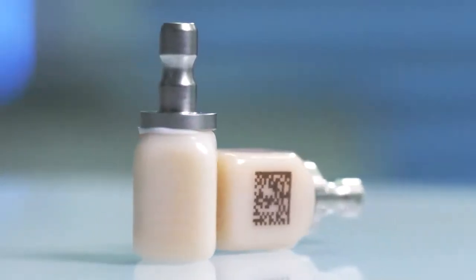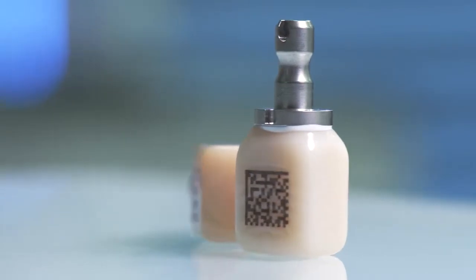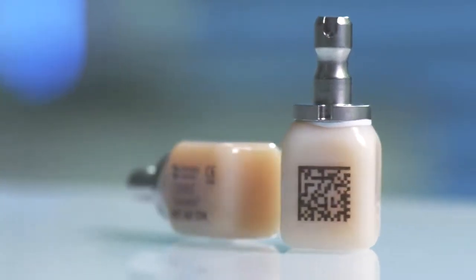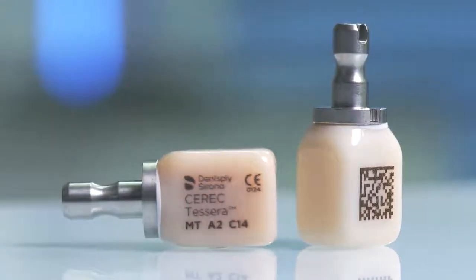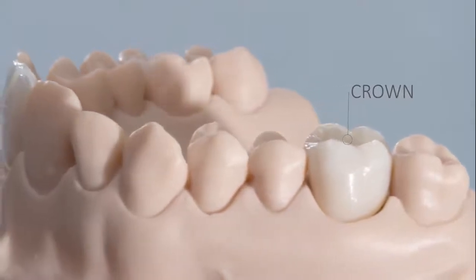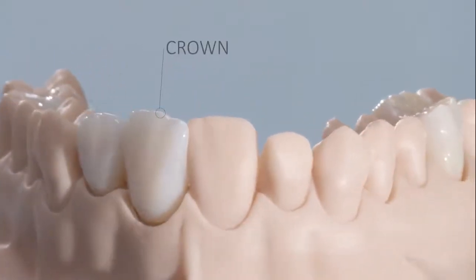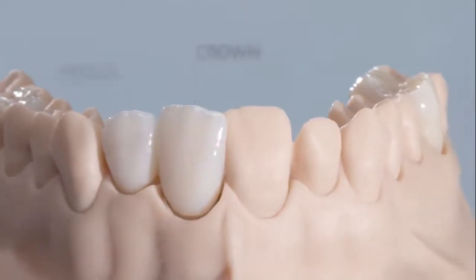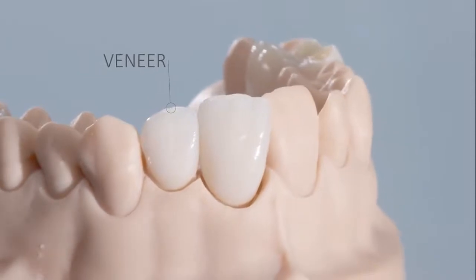With Cerec Ticera, Dentsply Sirona offers a high performance glass ceramic based on lithium disilicate, which combines maximum aesthetics with the highest strength of over 700 megapascals. As a result, Cerec Ticera offers both the safety for use in posterior teeth, for example as crowns and inlays, and the beauty for highly aesthetic translucent anterior restorations.